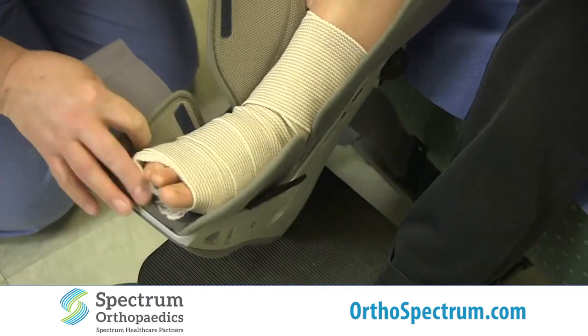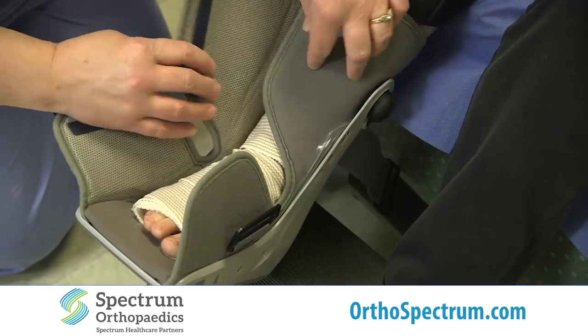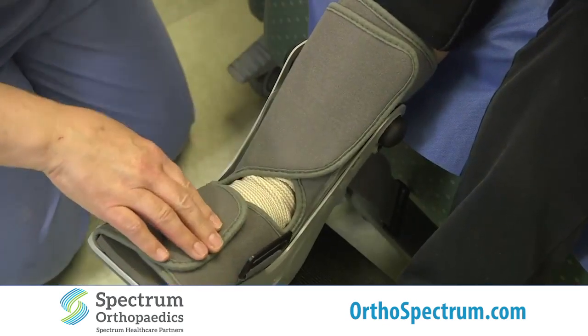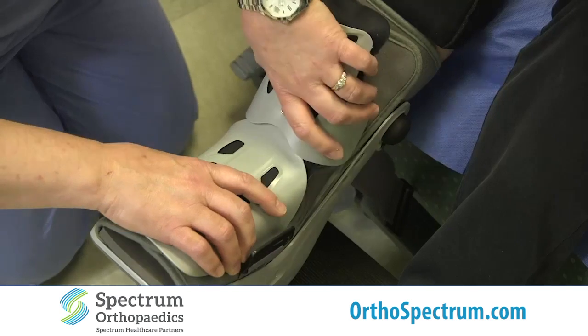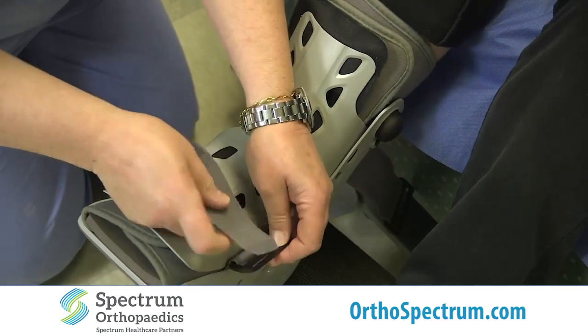We'll have Rachel put her leg back in, and then you would take this panel — it will fit right over, and there, since the word 'Air Cast' is on it, that should be on the toe portion.